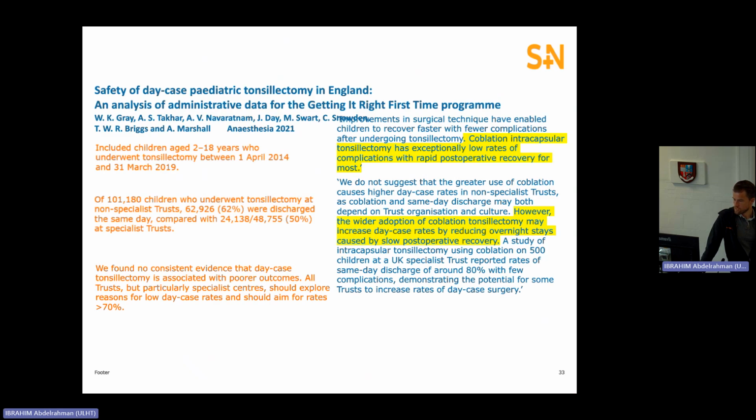Some of the recommendations here we've highlighted in the report. So you should consider coblation intracapsular, as it has exceptionally low rates of complication in regards to postoperative recovery. Wider adoption of coblation may increase day case rates, and that's one of their targets, by reducing overnight stays.